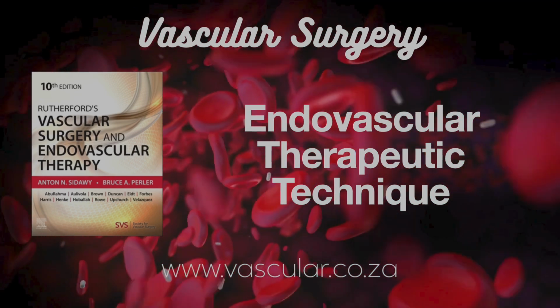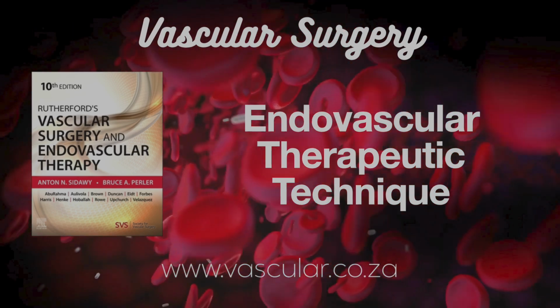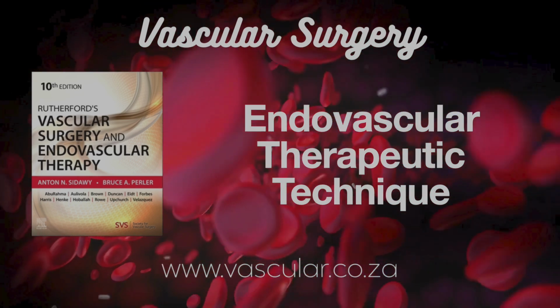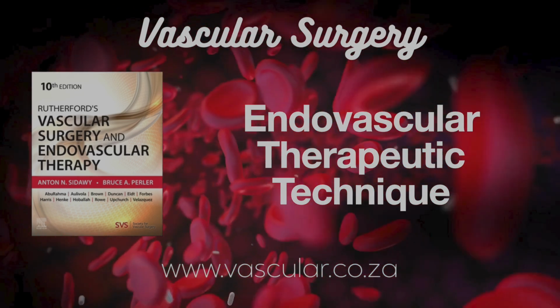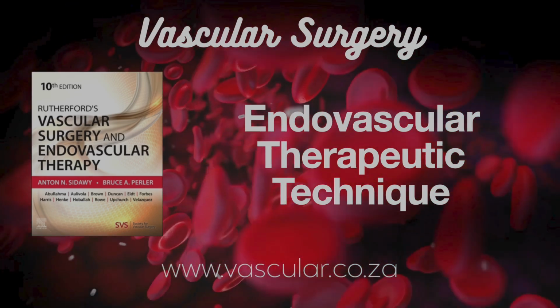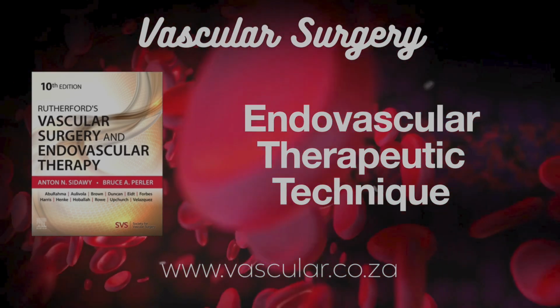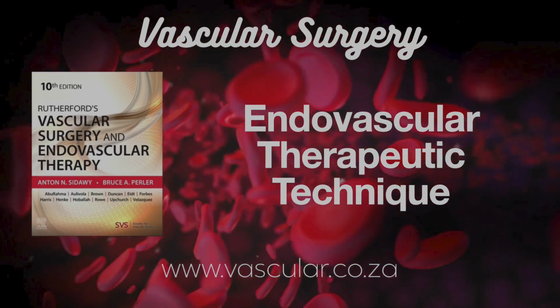And the Vascutrak, similar idea. Similar principle, different design. Vascutrak uses two thin wires running lengthwise. They estimate these create incredibly high focal pressure, maybe 50 to 400 times more than a standard balloon at the same pressure. Wow. Yeah. Evidence is still a bit limited compared to some others, but it's been reported as safe and effective when used to prep the vessel before a drug-coated balloon in SFA popliteal lesions. Focused pressure to help drug delivery and expansion. Okay, different ways to apply pressure effectively.